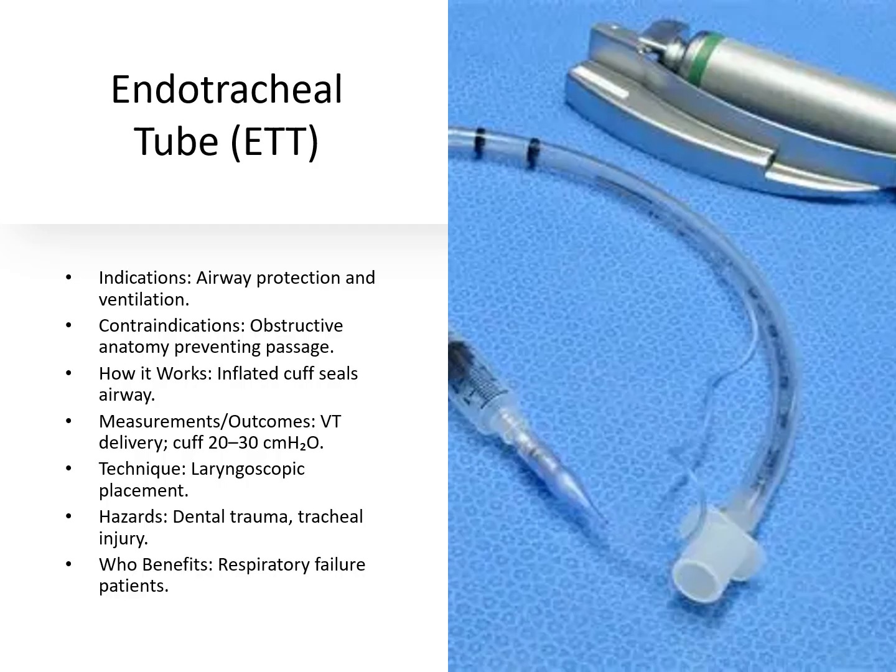Technique involves placement with a laryngoscope. Hazards include dental trauma or tracheal injury. Patients in respiratory failure benefit the most.